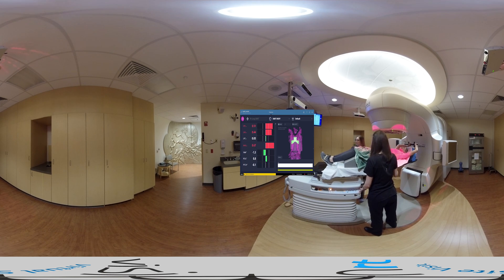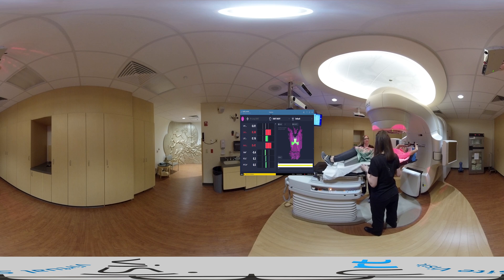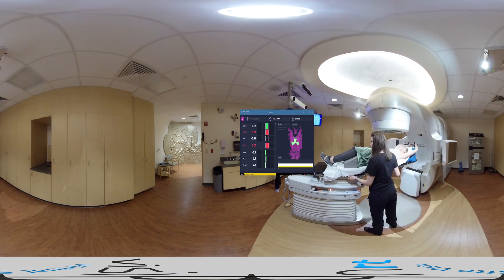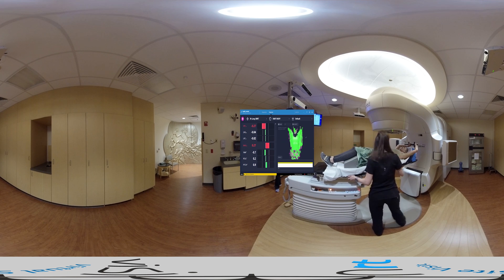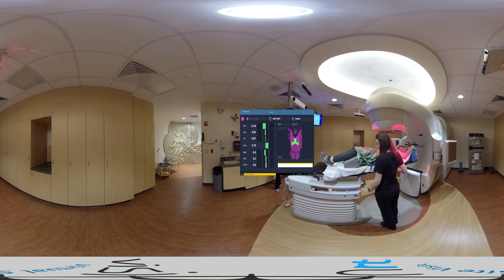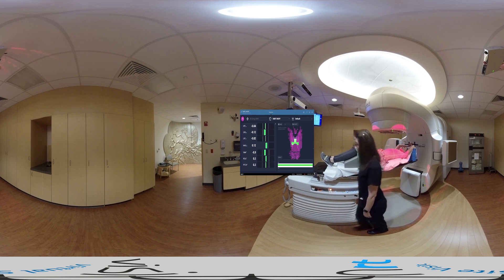The software compares the real-time surface data of the patient with the reference surface created by the CT plan data. We first correct for any postural misalignment by moving the patient to improve their position. We also capture a current treatment surface image in AlignRT, seen as green, to get a bird's eye view of any obvious surface misalignment and correct for these. We then move the couch to correct for any translation errors. When all the deltas in AlignRT are displayed green, the patient's initial alignment has been completed successfully.